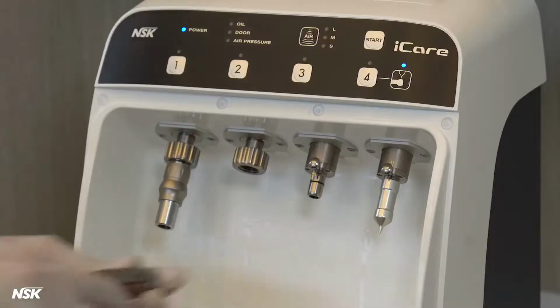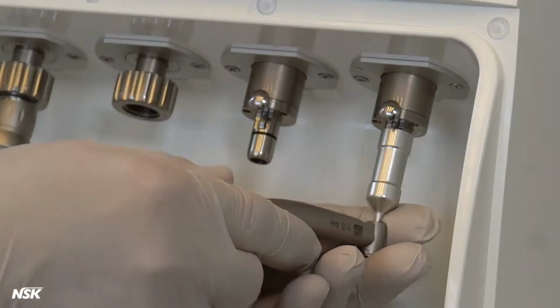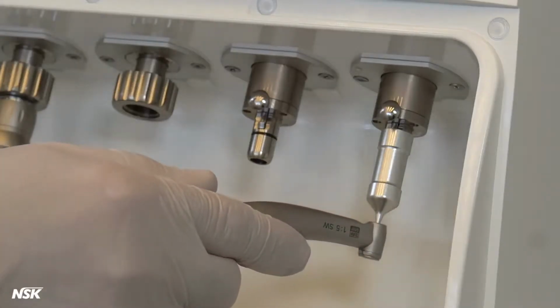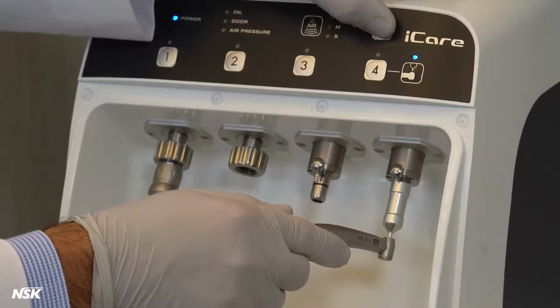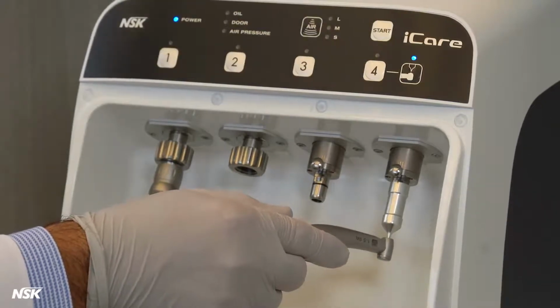Hold the handpiece so the tip of the nozzle is inserted into the burr insertion hole of the handpiece. It's important to hold the handpiece firmly as oil will be purged into it. Press the start button to begin the chuck cleaning process, which should only take 4 to 5 seconds.